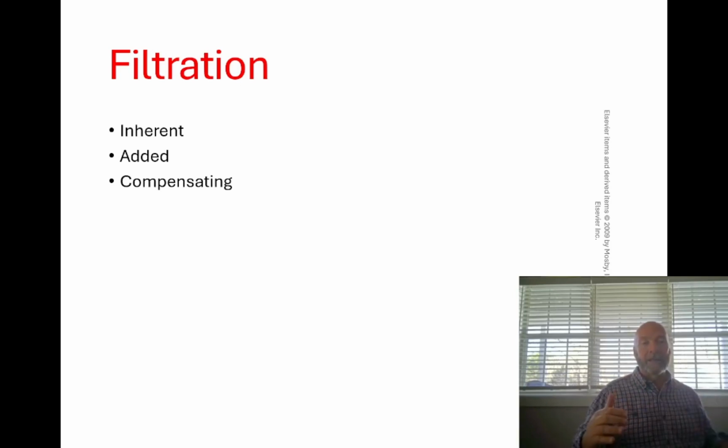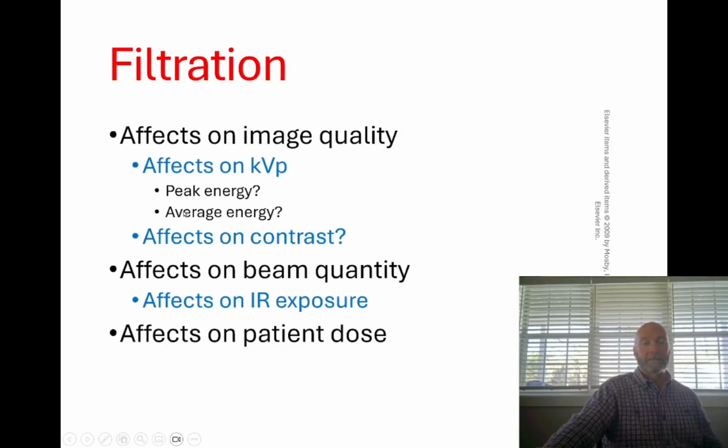That is still an inherent filtration. It's just an increased inherent filtration. And we consider it an inherent filtration because you just can't get rid of it. You can't take it out. So you can't separate that from the X-ray tube, and it just becomes a portion of the system as inherent filtration.